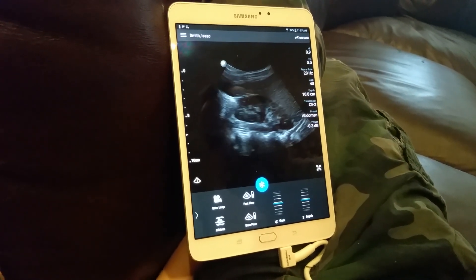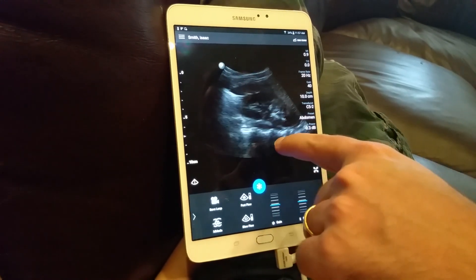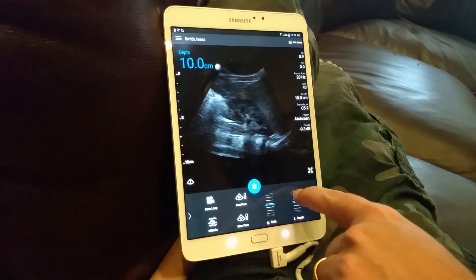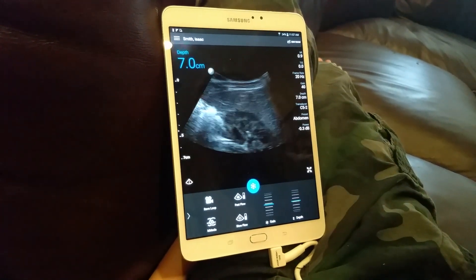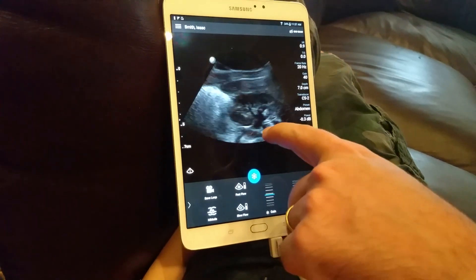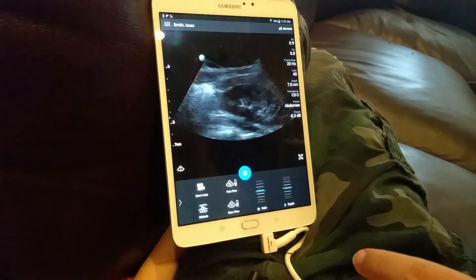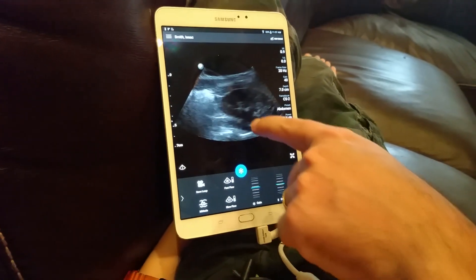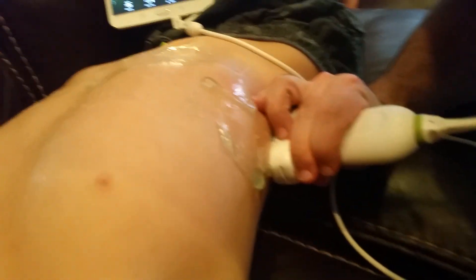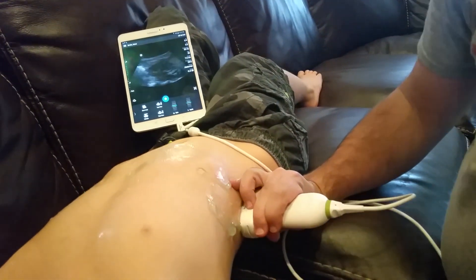There is the kidney. I don't see any hydronephrosis. Zooming in a little more, you can start to see the collecting ducts and even the small pyramids. That's a good picture of what the right kidney looks like.